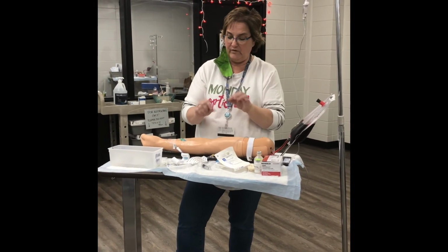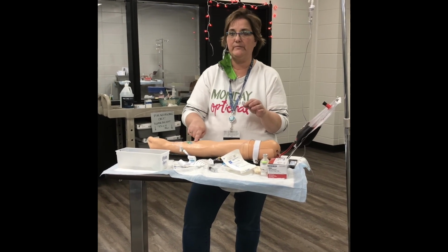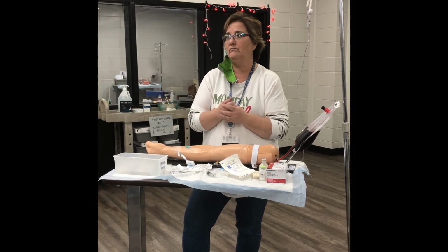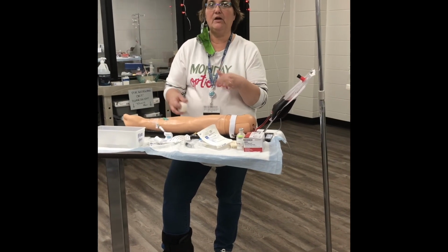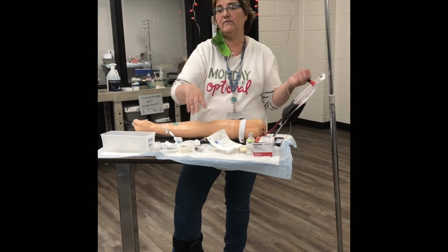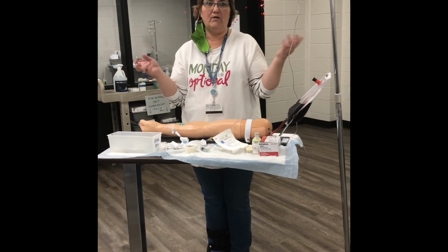So you would fill that in and put that somewhere on your site, again, not anywhere on top of your transparent dressing though. And if this person is going to be in the hospital, you may want to cover it with some tape, because as they bathe it's just going to fade and fall off, even though the dressing is going to be changed every 3 days or however long they do it.